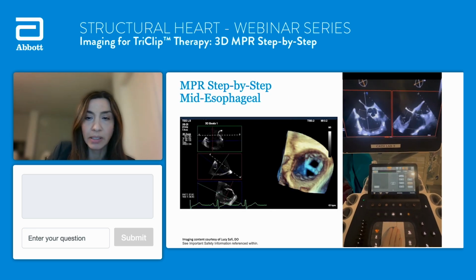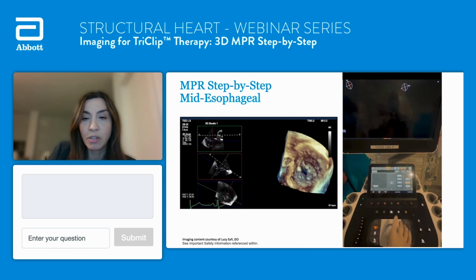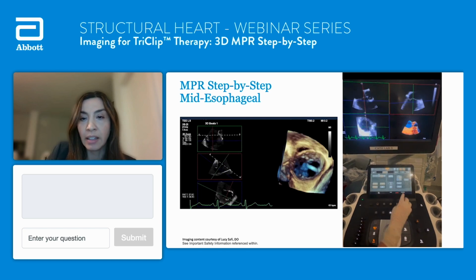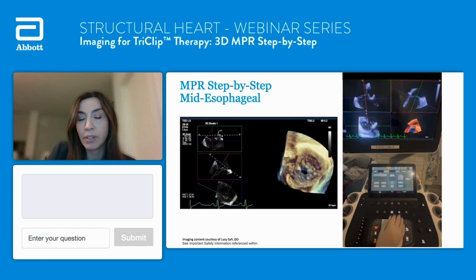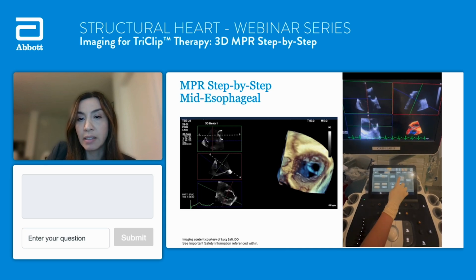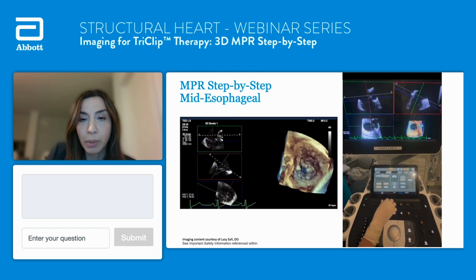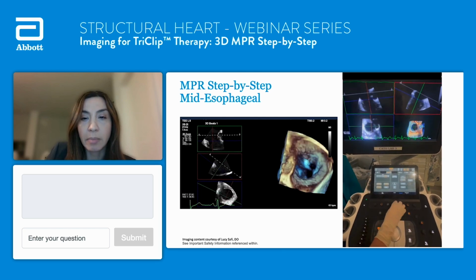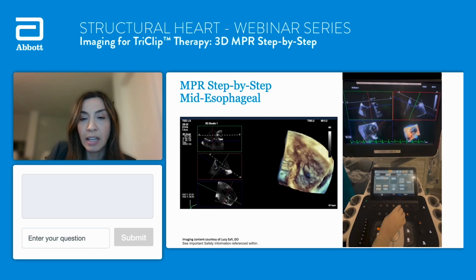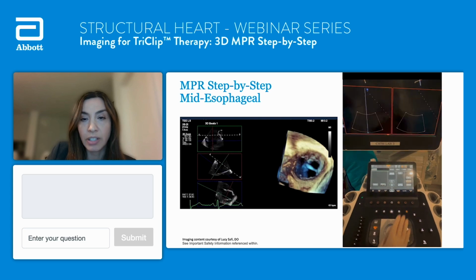And so let's build it. It really doesn't take too long. So we optimize our 2D image, we get a 3D zoom, and we immediately lock our planes. And then I usually like to orient my red plane first. So you can see that I'm lining my blue cursor in the red box. And then I move on now to the green plane, and I'm orienting my blue plane right at the tricuspid annulus. I'm rotating now my aorta to be at 5 o'clock, and I'm placing my red plane through the coaptation in order to get my grasping view.